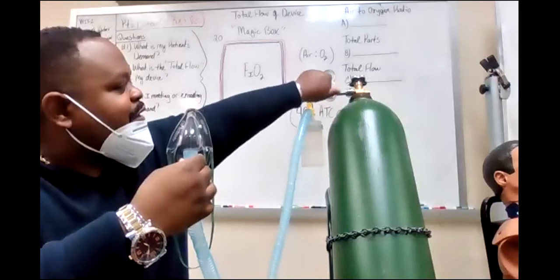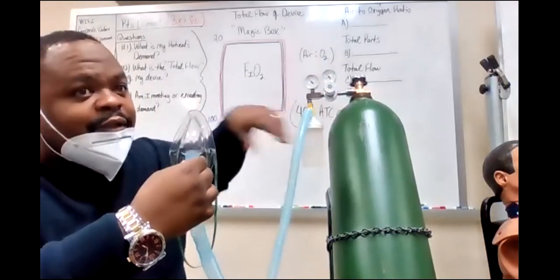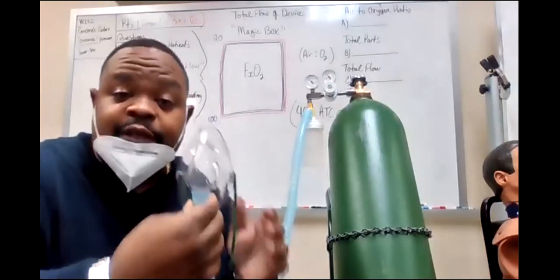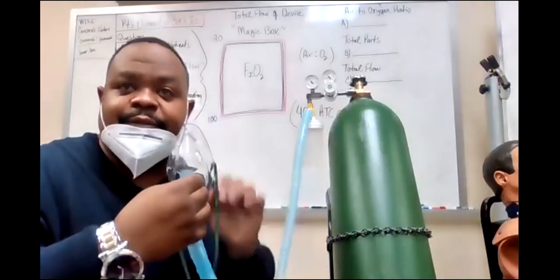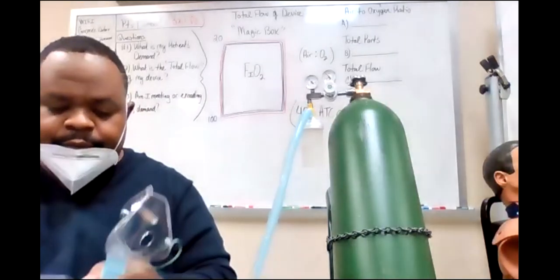Okay, cut it down because it's kind of loud. Let's just say that's 12 because I can't hear me. This is an aerosol face mask running at 12 liters per minute. Okay. Hold on, let me let my daughter know I'm a little behind.